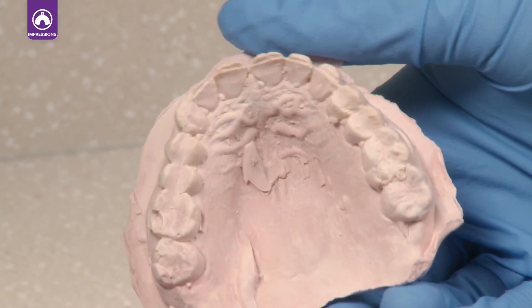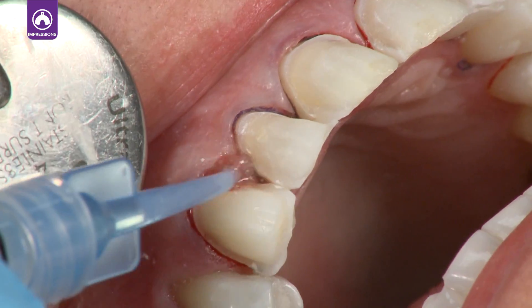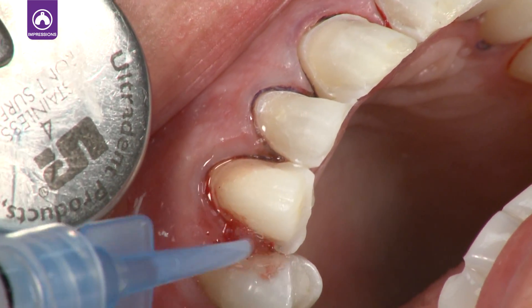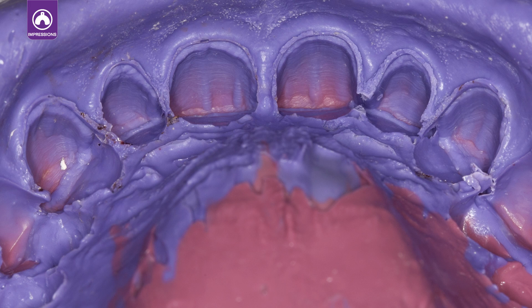Good impressions begin where great tissue management ends. Predictable hemostasis and retraction provide impressions with detailed margins and decrease costly impression remakes.